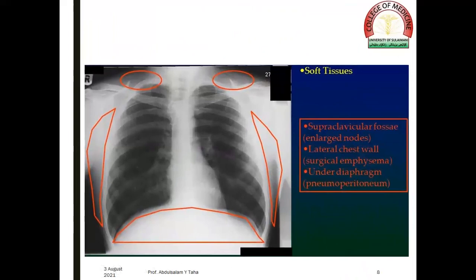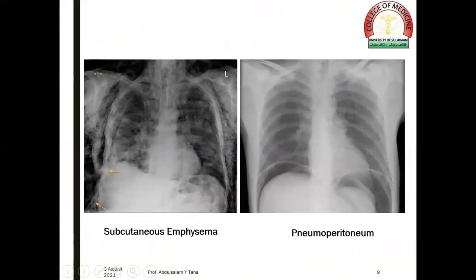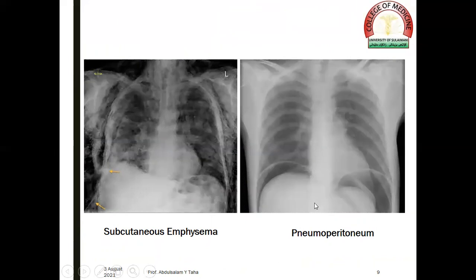The soft tissues are examined systematically, starting from the supraclavicular fossa — in which lymph node enlargement may be seen — the chest wall, in which surgical emphysema may be observed, and the region under the diaphragm, in which pneumoperitoneum may be observed. In this slide, we can see subcutaneous emphysema on the chest radiograph on the left side: a radiolucent shadow in the soft tissue of the chest wall, the neck, as well as the mediastinum. And on the right side, we have pneumoperitoneum — air under both diaphragms.